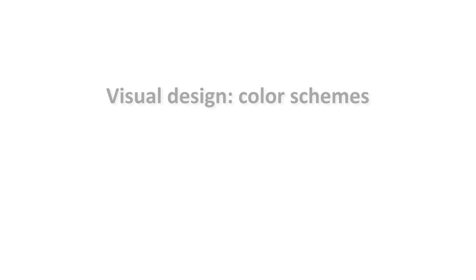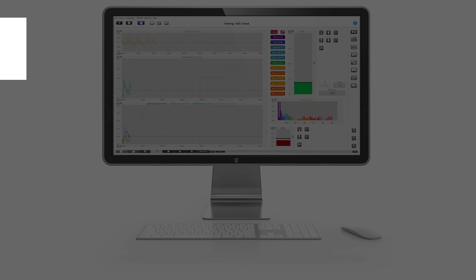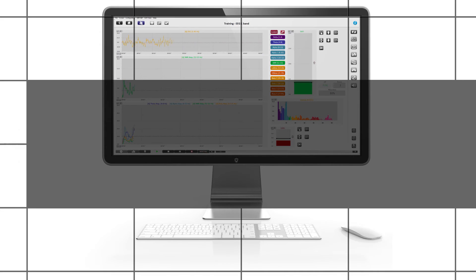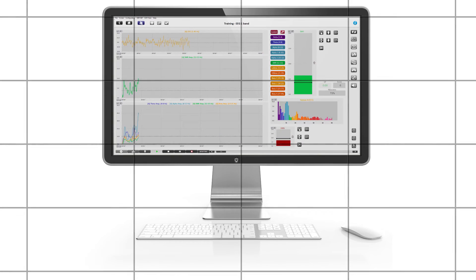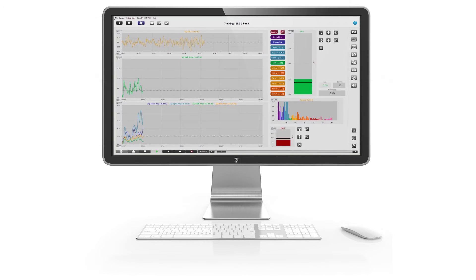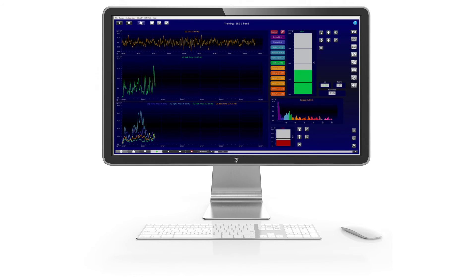BioTrace Plus now supports color schemes. With this new feature, you can change the color design of all screens with a single mouse click.